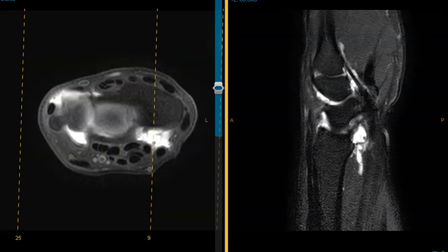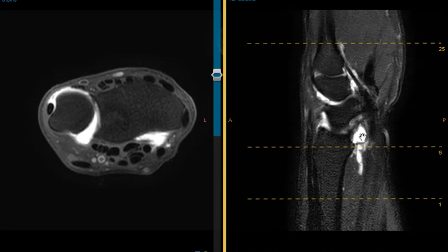And so again, if we see a fluid collection here, rather than calling it a ganglion cyst like it happens very often, we should call it a probable prolapse of joint fluid, a little developmental defect of the joint capsule. And that's it.